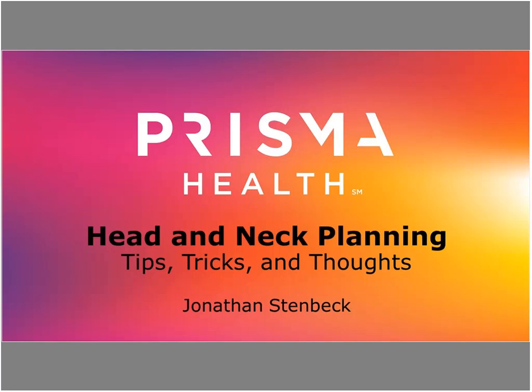I'm going to be talking about head and neck planning. I put tips, tricks, and thoughts on there. I just couldn't really come up with a better title, and figured content would be more important than the title.